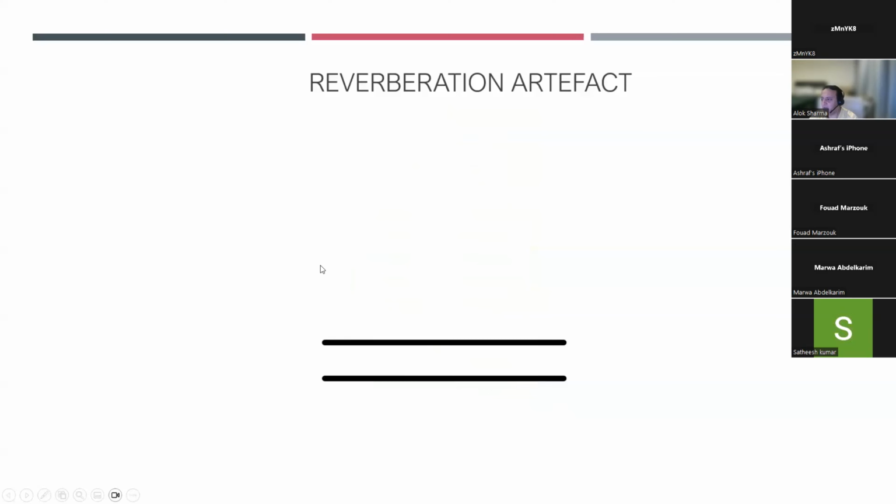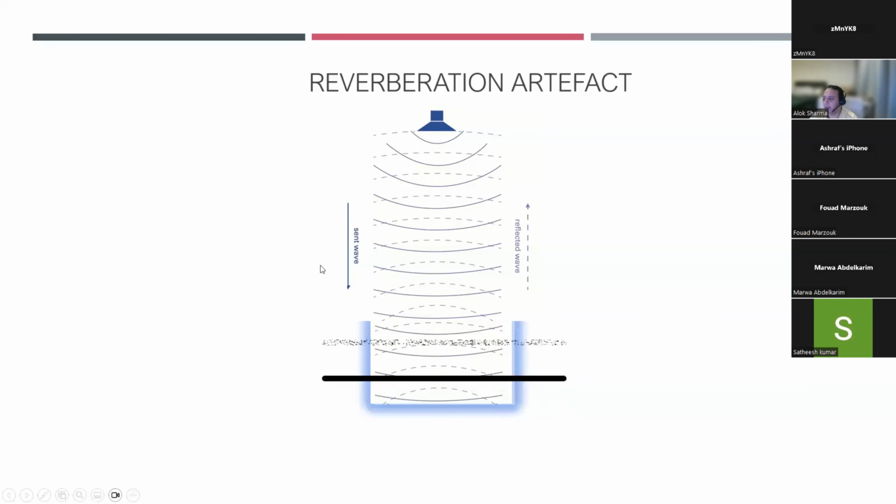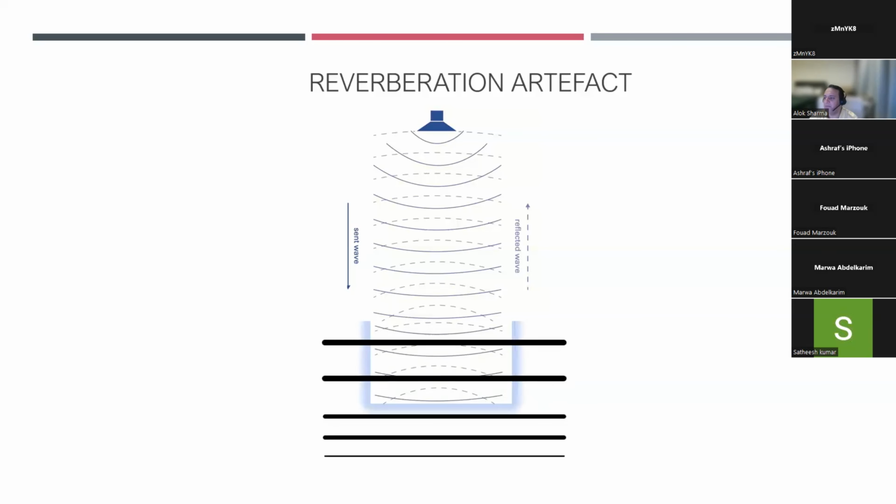But as I've shown you in this particular image, they're trapped. The trapping of them in this zone means that this reverberation just carries on as you go lower down. But because of absorption and the process of attenuation, the A lines look less prominent as you move down. They are actually being created at the level of the pleura.